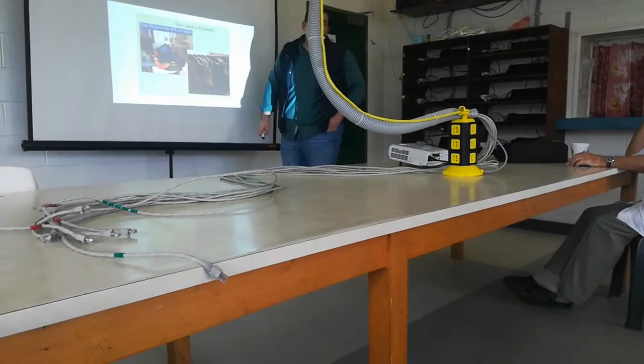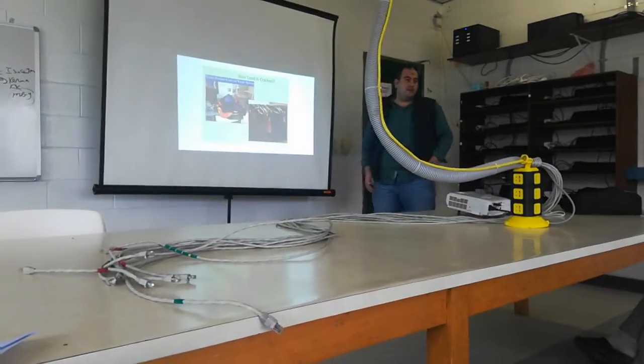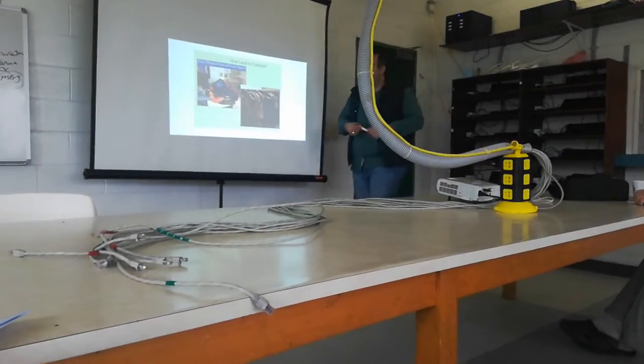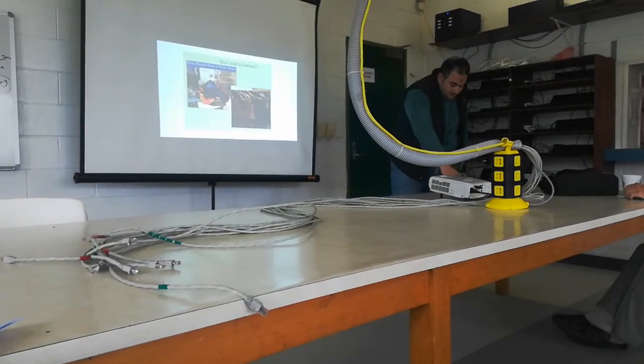Take proper care of your apron. It's very important not to stretch your apron like that, because it may cause cracks in the lead apron.